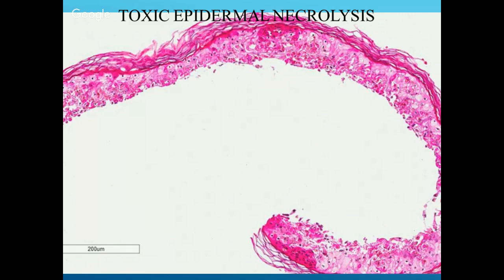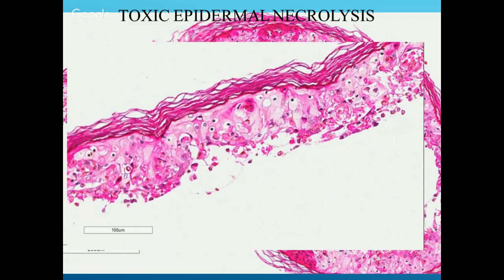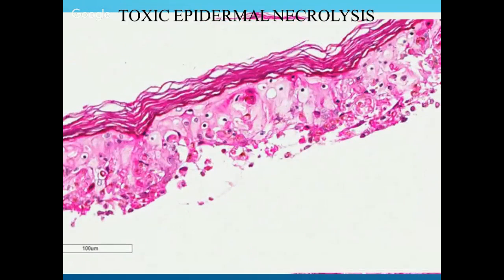syndrome. So the important feature to recognize in toxic epidermal necrolysis is there is complete epidermal necrosis. In staphylococcal scalded skin syndrome, which is a vesicular-bullous pattern, which we'll see in the next reaction pattern, there is no necrosis. So this one, there's a lot of necrosis. So if you see a skin that is completely necrotic epidermis, then you're most likely dealing with toxic epidermal necrolysis actually. So this is completely necrotic epidermis, a lot of dyskeratotic cells. So that is toxic epidermal necrolysis.